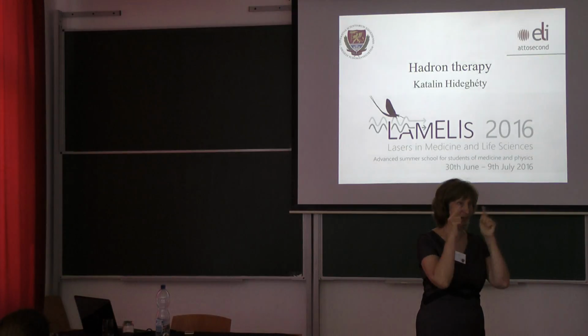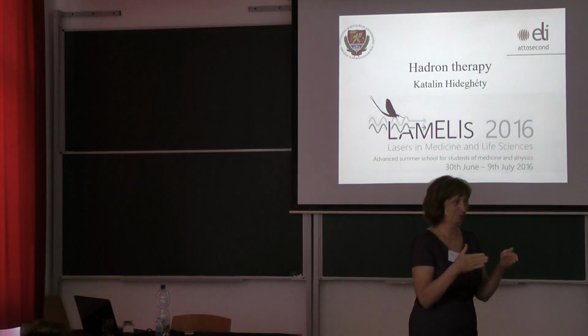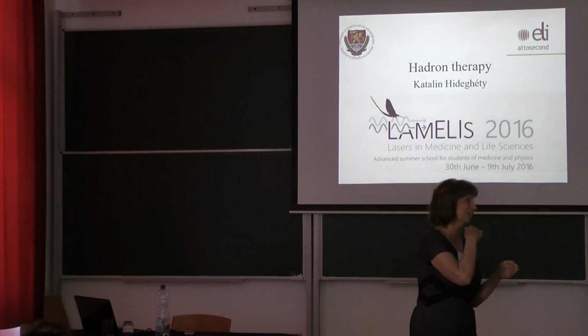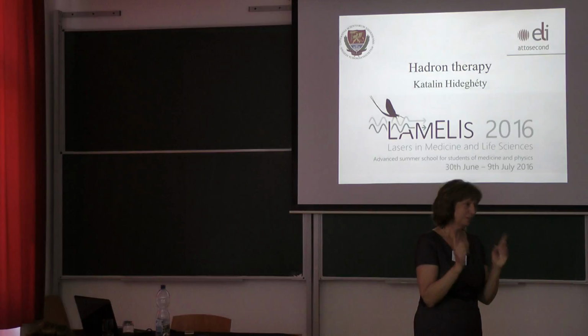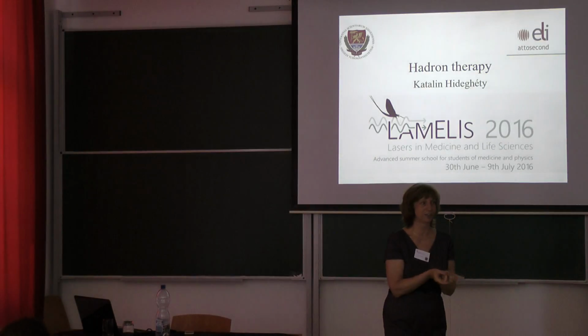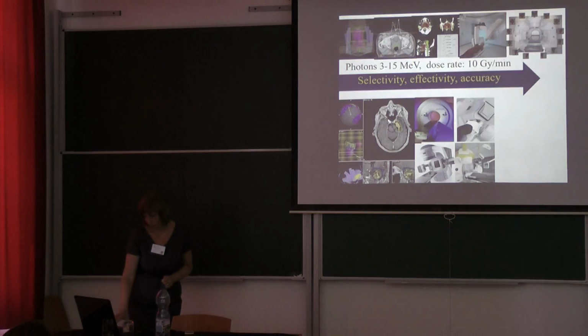First the algorithm was focused on the PET-CT data, on the high uptake value, as well as defining the static thresholds, and thereafter the MRI helped the program to find the contour of the tumor. And now we go to the hadron therapy.